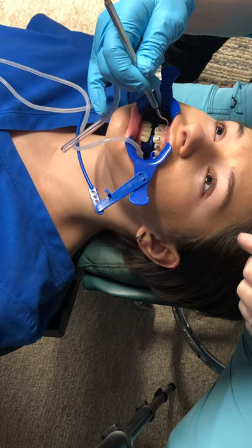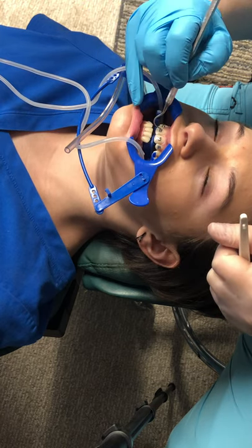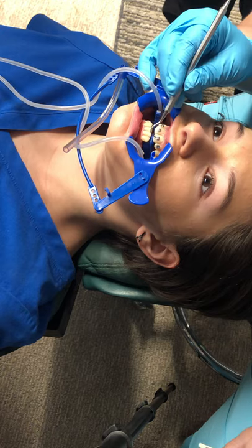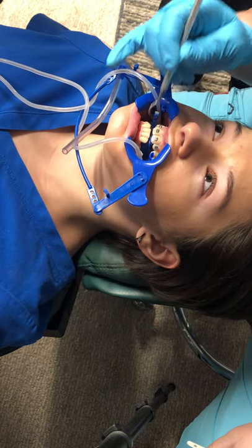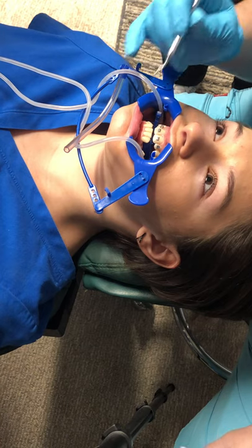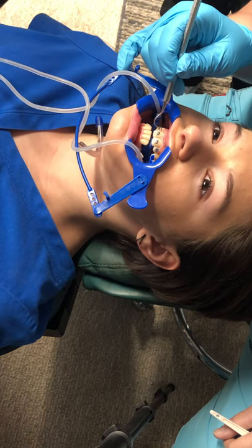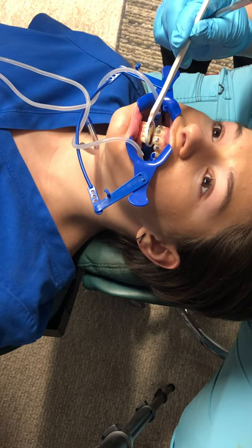We're going to take off that excess, and you'll see them put it on their glove and then straighten that bracket right where it used to be. Sometimes that glue will go up under a tie wing, and when that happens they'll take a quarter-round burr and clean it up so that you can put the power O around it or the ligature tie. They're going to check it, make sure it's seated all the way, and then say 'okay, light them up.'